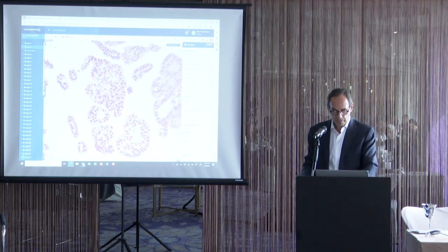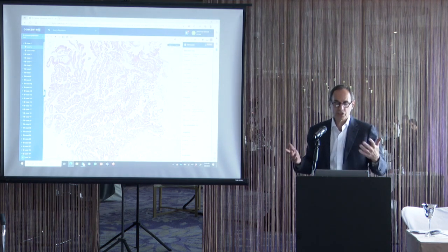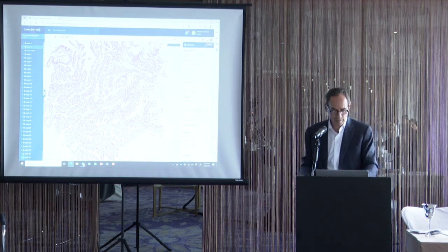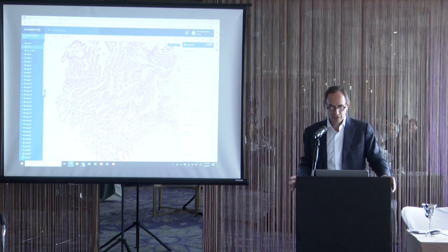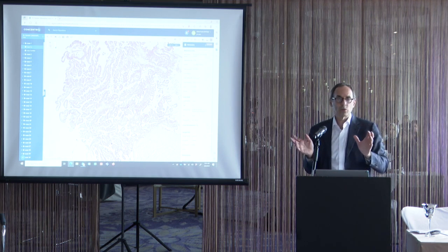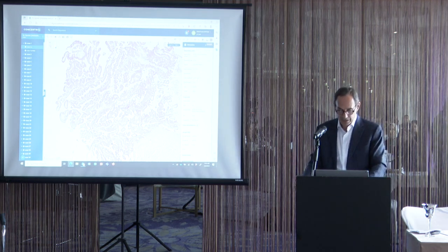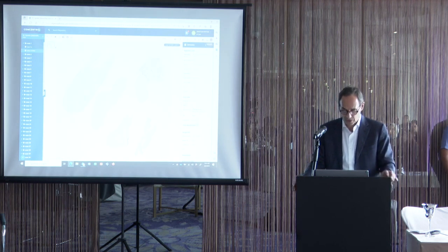Now, in the past, I would have looked at this case and said, okay, this is prostatic ductal adenocarcinoma, Gleason score 4 + 4 = 8, because that's what we call papillary prostatic ductal adenocarcinoma, Gleason pattern 4. But now, based on cases that I've seen and studies that I've done, I recognize that prostatic ductal adenocarcinomas can uncommonly be confined only within the ducts and not be invasive, just like usual prostate cancer. So when I see a case that's not overtly invasive, such as this case with these exophytic papillary structures, I will do special stains for basal cell markers.